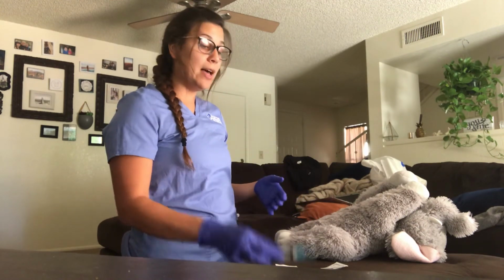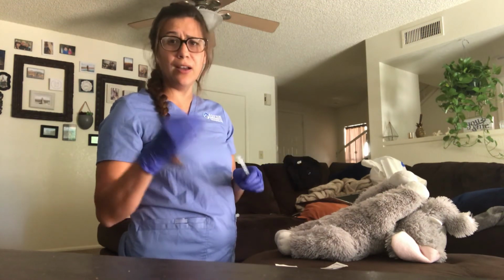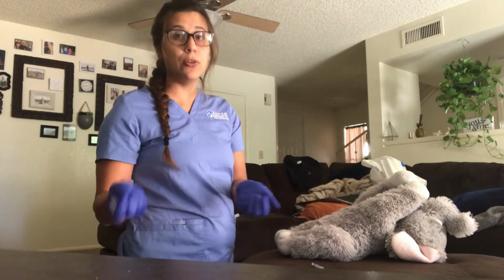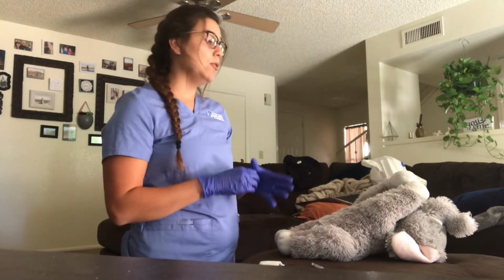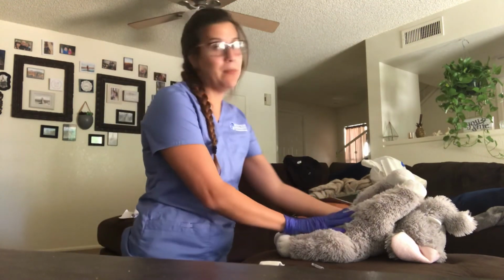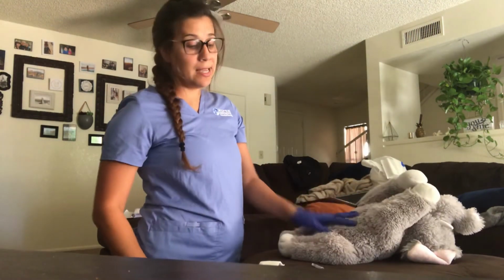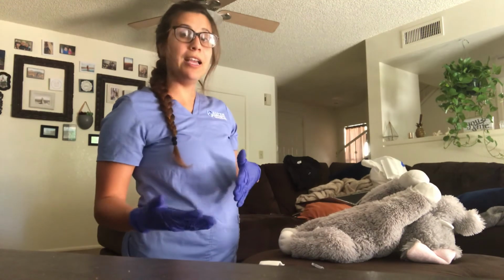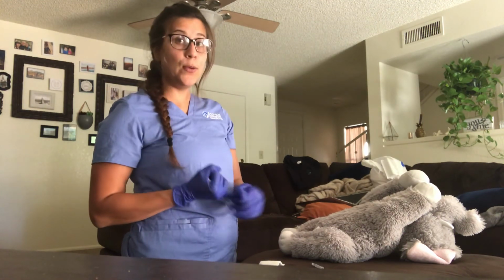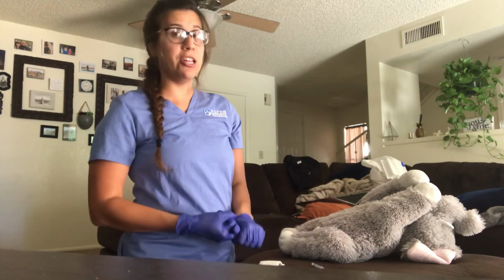You want to put this in the sharps container, and anything else, like if you had a hub or anything like that, you put it in the sharps container. You'll throw away all of your supplies, including your gloves. At this point, before you let go of your gloves, you could put the patient in an upright position or however comfortable they want to be. Throw away your gloves, hand hygiene, and you want to document. You are documenting the medication that you gave, the dose that you gave, as well as where you gave it, so the site of the injection.